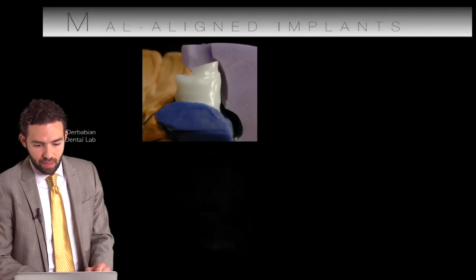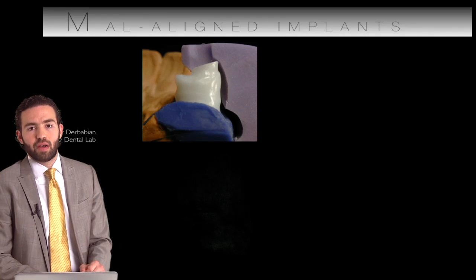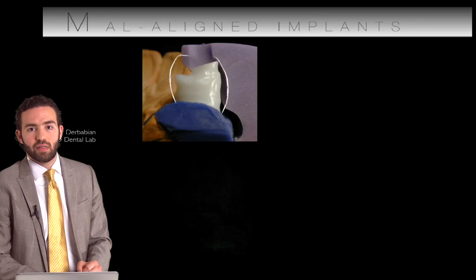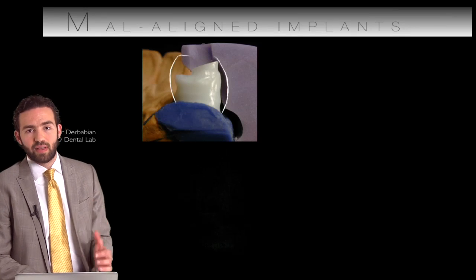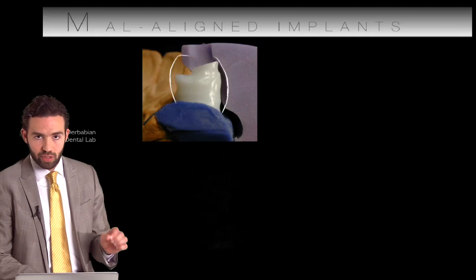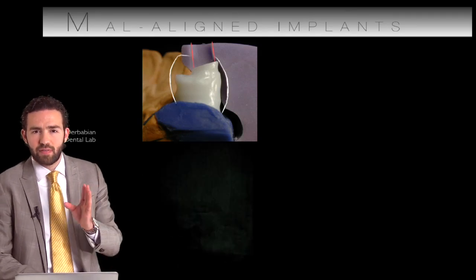So I'm going to demonstrate that with a case here where the implant restoration has been placed and it's a bit more towards the buccal area. It's not quite going through the buccal surface, but it's not really in the center of the occlusal surface as well. So it's somewhere in between. And if you'd like to keep the restoration in a screw retained pattern, we see here we can design the framework to be made out of zirconia, providing good support for the veneering structure. And you see the occlusal, or the chimney of the implant restoration, is more towards the facial side.